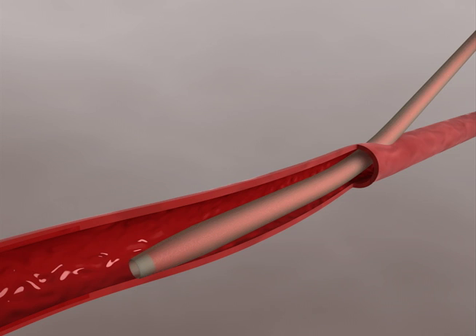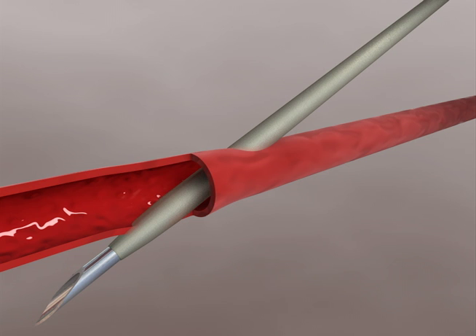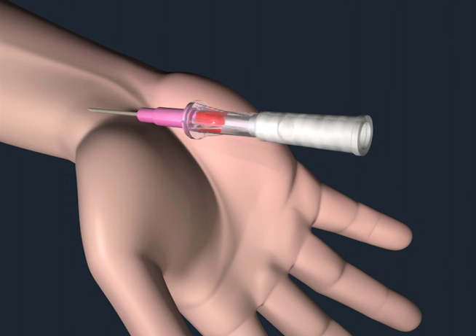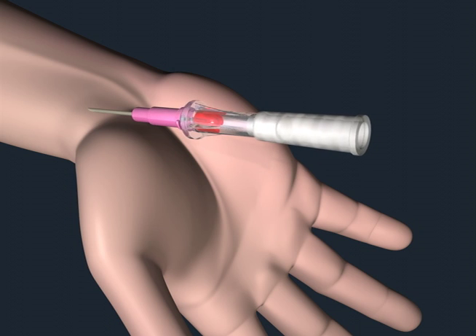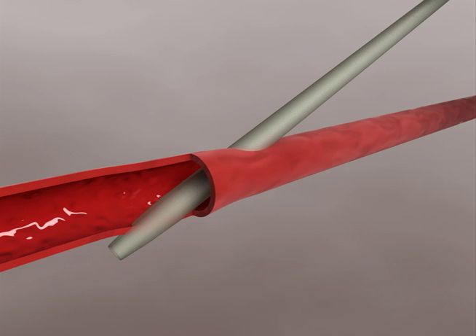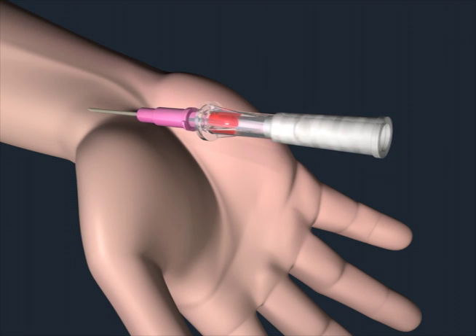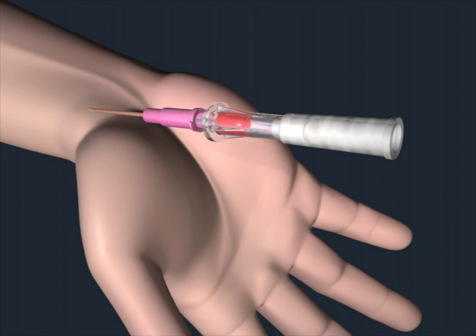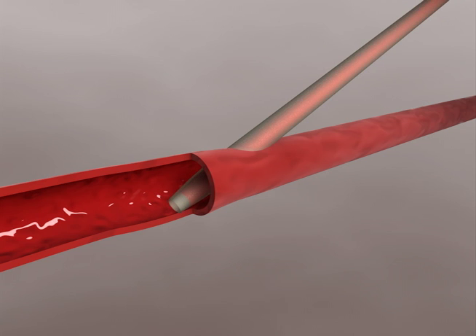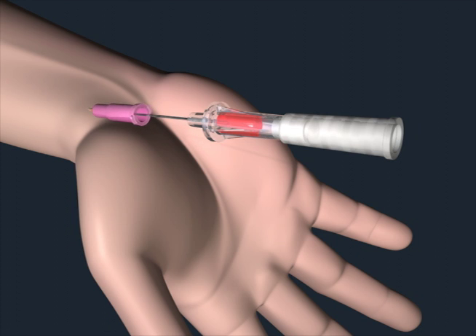Now let's look at what happens when the needle and catheter have both gone through and through. When the needle is withdrawn into the catheter, flow is not reestablished. Now the catheter and needle are slowly withdrawn as a unit until flow resumes via the catheter tip. The catheter is then advanced off the needle while making sure flow does not stop.